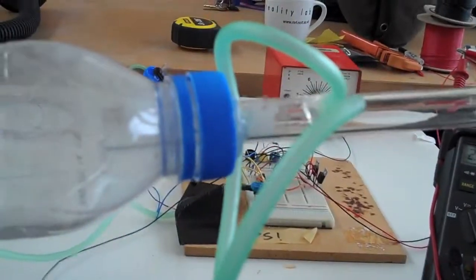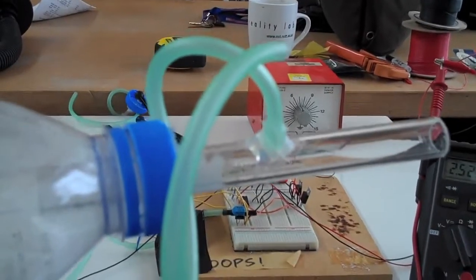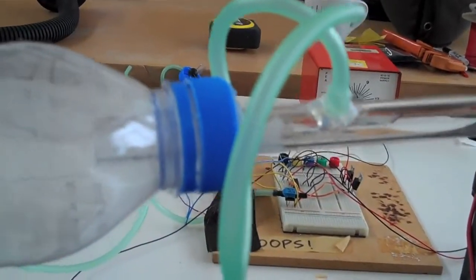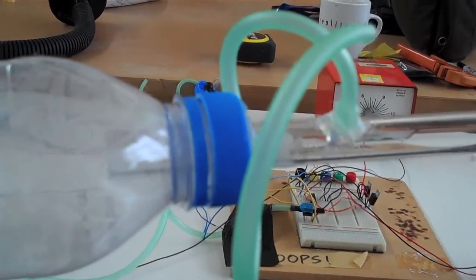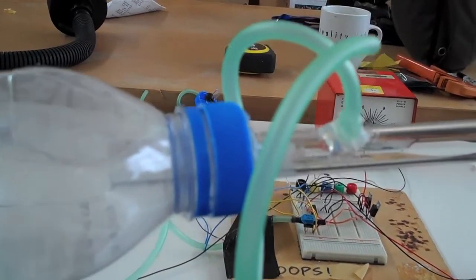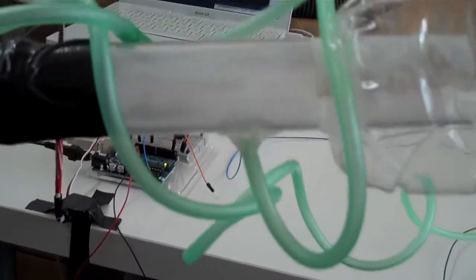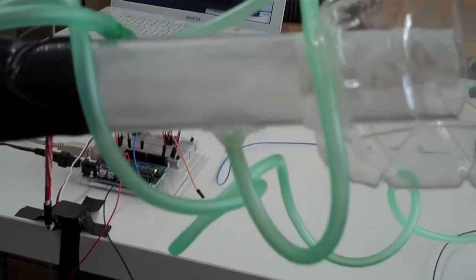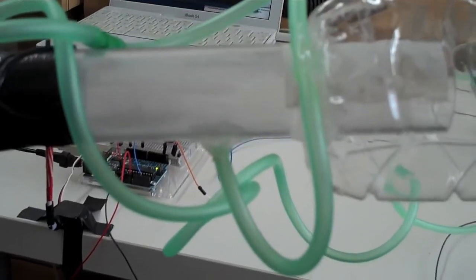I actually found that monitoring the pressure only in the rear tube and comparing that to atmospheric pressure gives a really good reading, because when using the front pressure gauge, which for the calculations should be right, the pressure differential when you inhale is significantly smaller than exhaling. But just using one pressure measurement and comparing that to atmospheric pressure as a constant, you get a very good flow rate indication for both inhaling and exhaling.